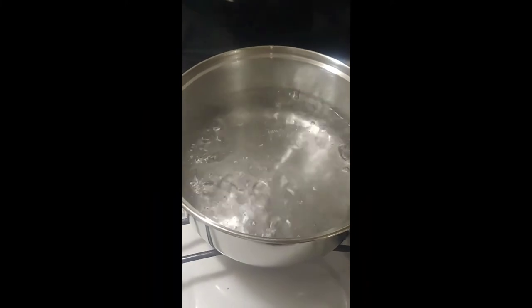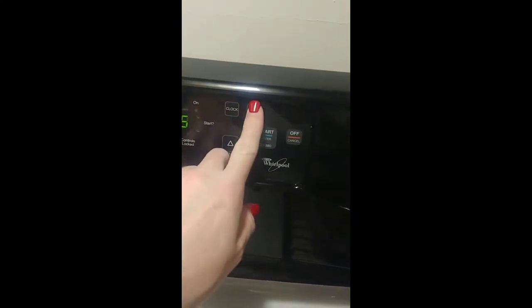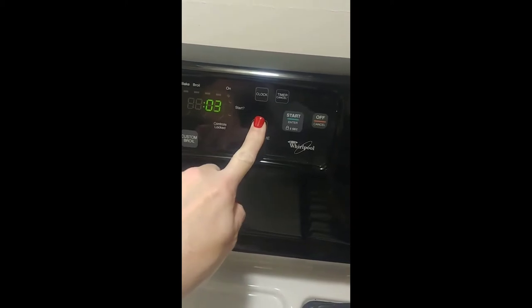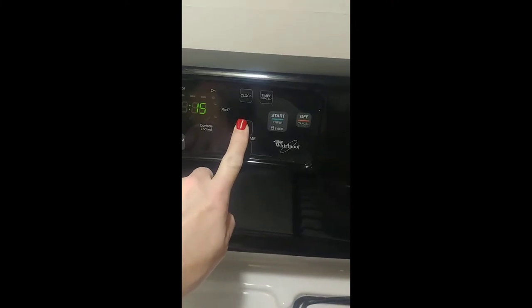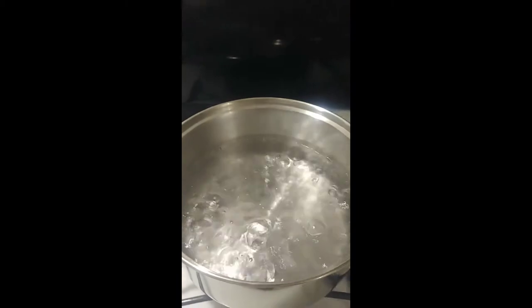My water is already boiling, so I'm going to set my timer. I'm going to set it for 15 minutes. I don't usually have to heat it this long, but for this video we're going to.